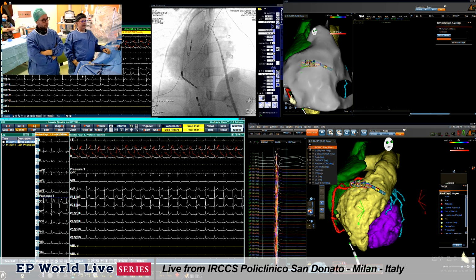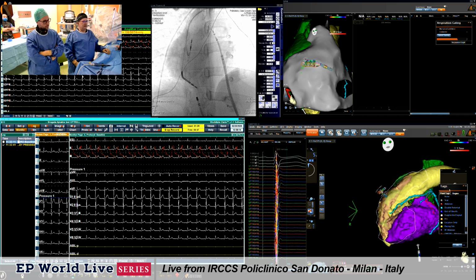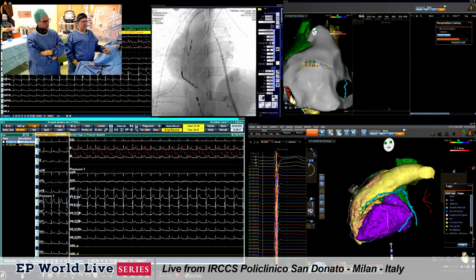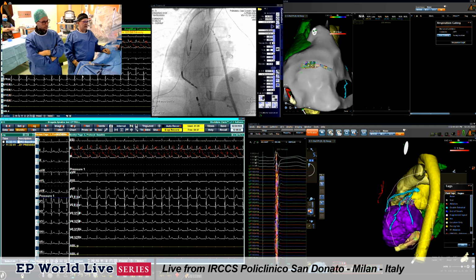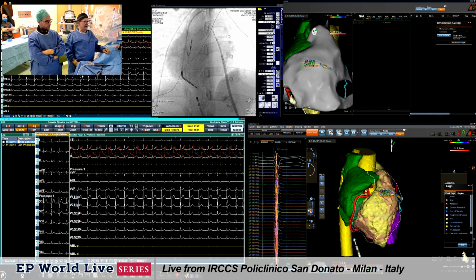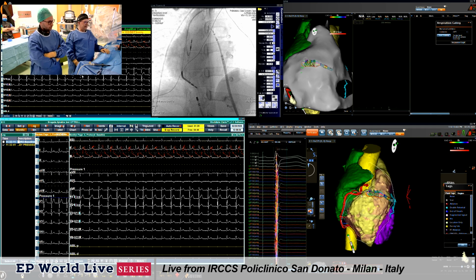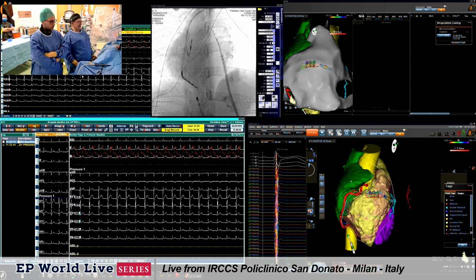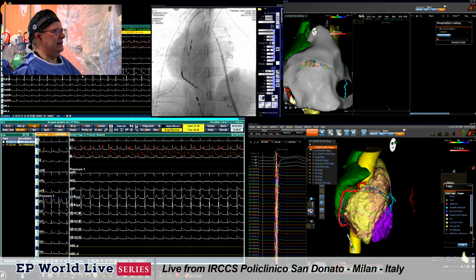Very clearly, you can see the right ventricle. Behind the right ventricle, let's see the left ventricle, Beniamino, okay? And you see the coronary artery is well localized only on the left. This is the interventricular artery. Go to the right, please. And you see the right coronary artery determining the border between the right ventricle and right atrium and left ventricle. So we already went into the pericardial cavity.